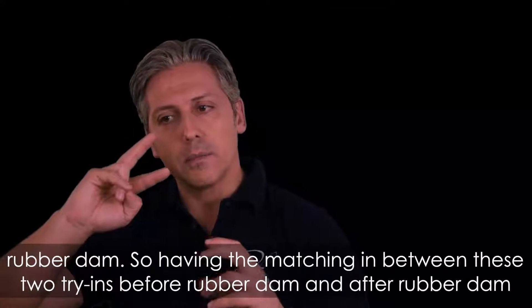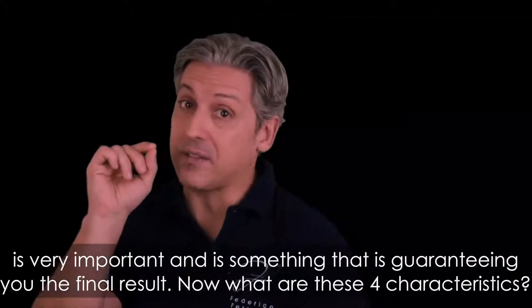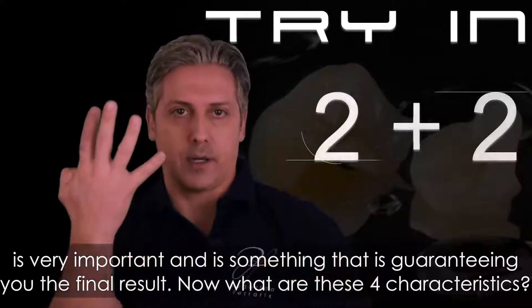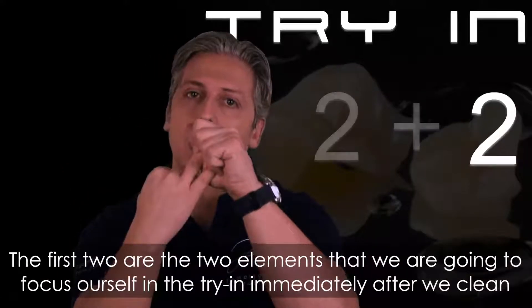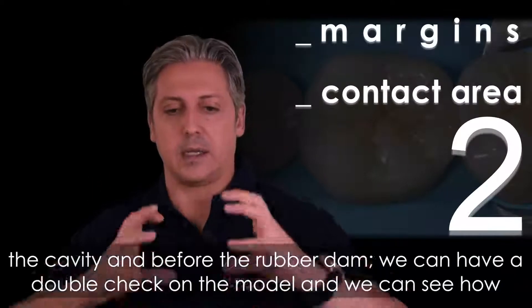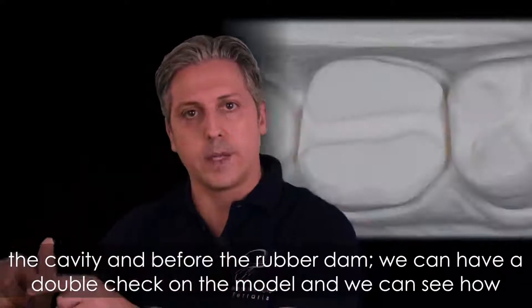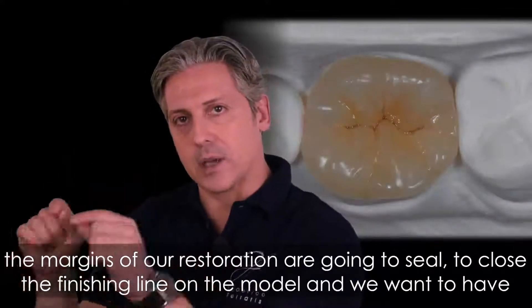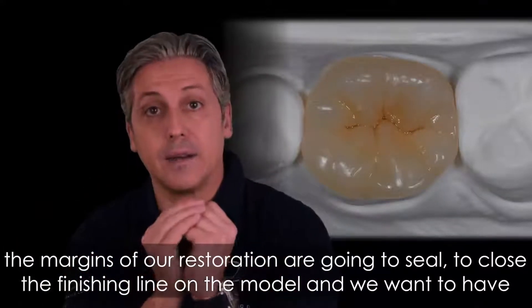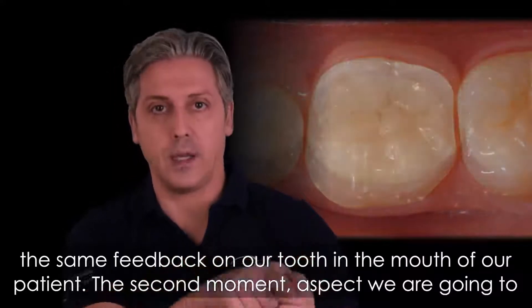Having a match between these two try-ins — before rubber dam and after rubber dam — is very important and guarantees your final result. There are four characteristics to consider. The first two are the elements we focus on in the try-in immediately after cleaning the cavity and before the rubber dam. We can double-check on the model and see how the margins of our restoration seal and close the finishing line on the model, and we want to have the same feedback on the tooth in the mouth of our patient.